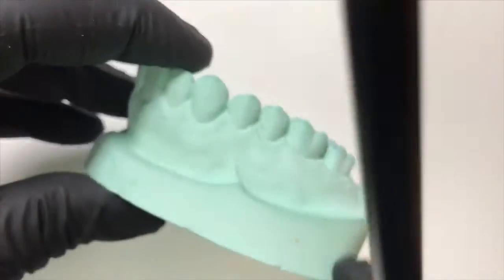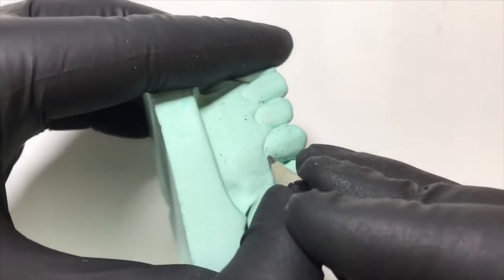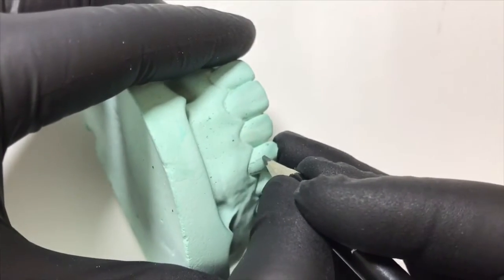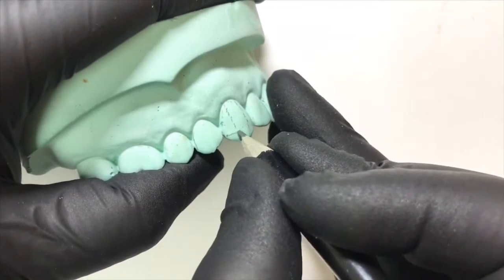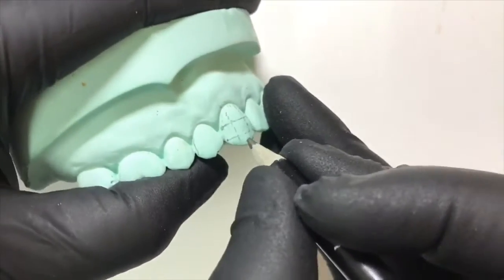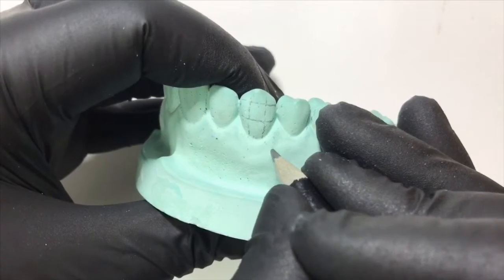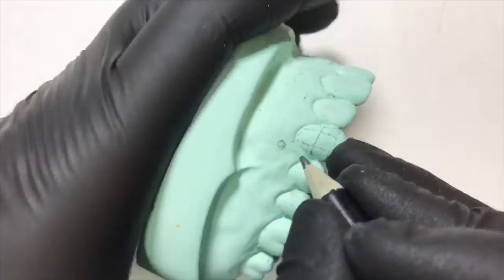First thing we need to do is some markings. On the buccal aspect of the canine we divide the tooth into three sections: the distal third, the middle third, and the mesial third. We also divide it into the incisal third, the middle third, and the cervical third. The helix should be placed just between the premolar and the molar, and it should be as high as possible.